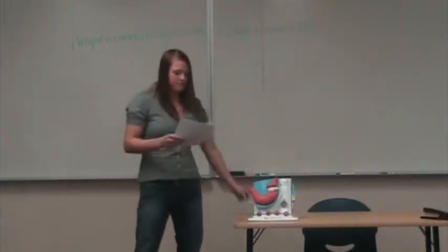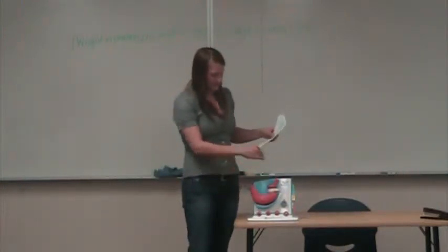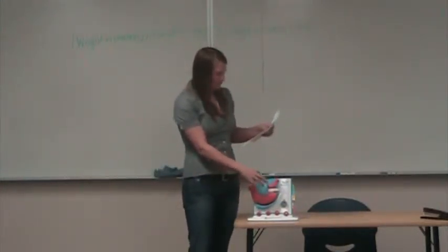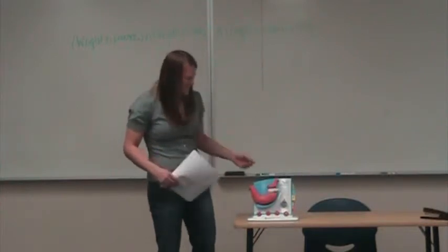What is the lap band? This is an actual lap band. It's a sampler, but this is a lap band. The lap band is a small plastic tool that helps you lose weight. It is a system that helps you gradually lose and control your weight by reducing the amount of food that your stomach can hold at one time. The lap band is placed at the top of your stomach like this and is designed to narrow the passageway so food can't get in your stomach as fast.